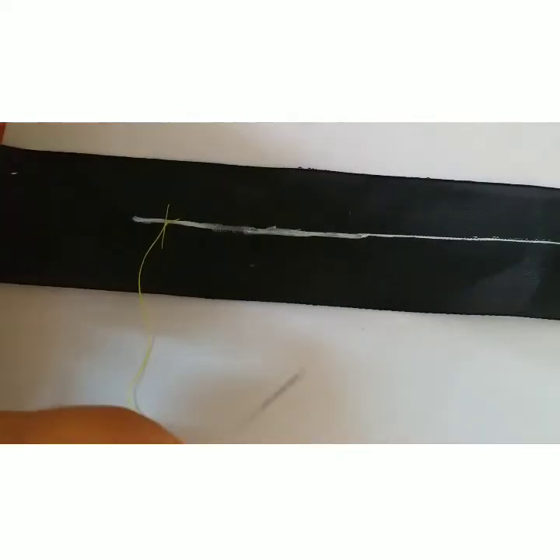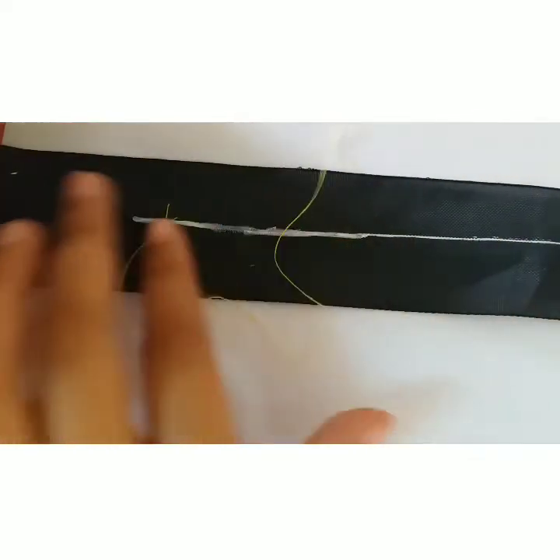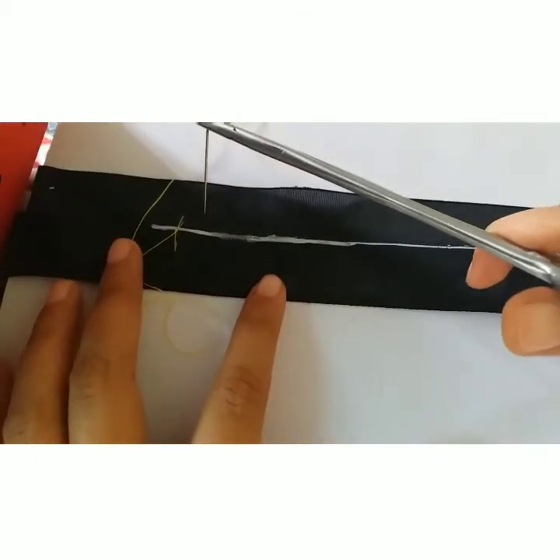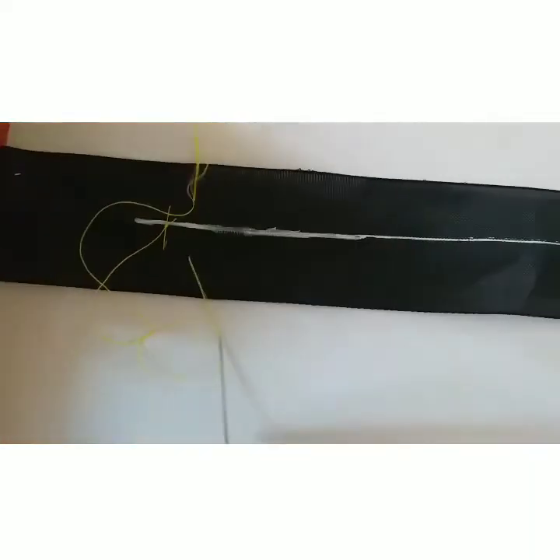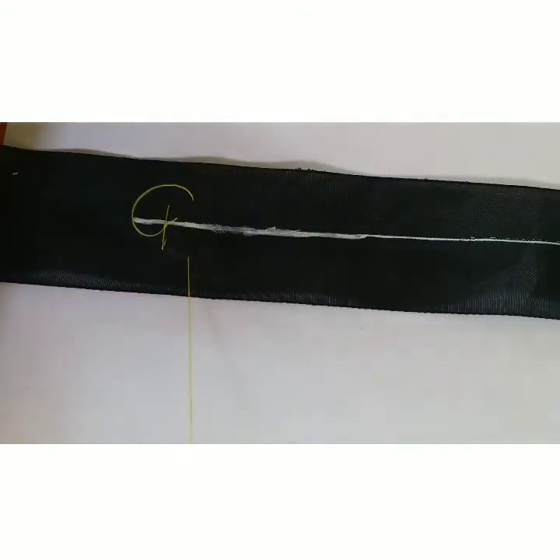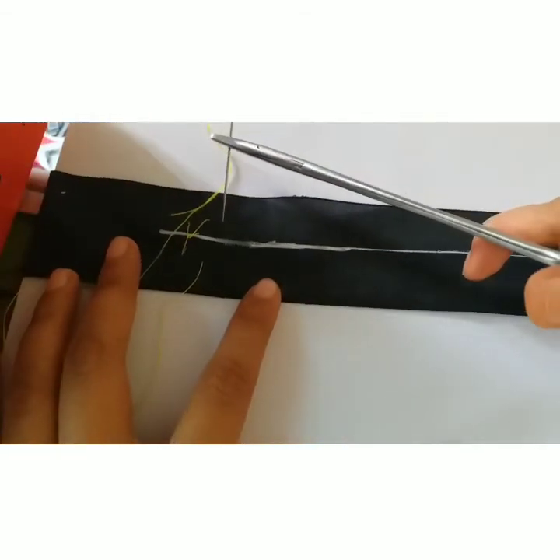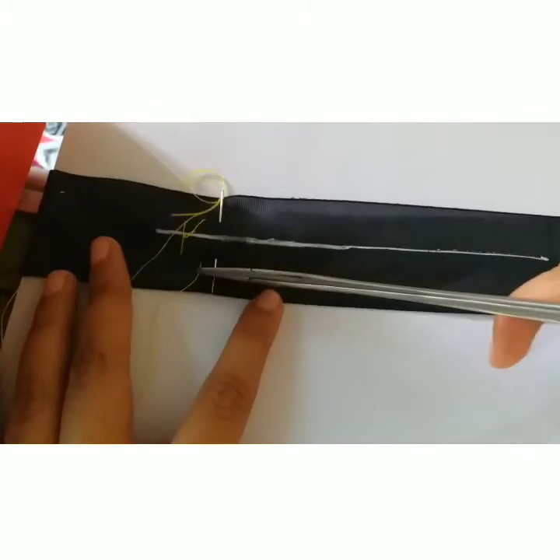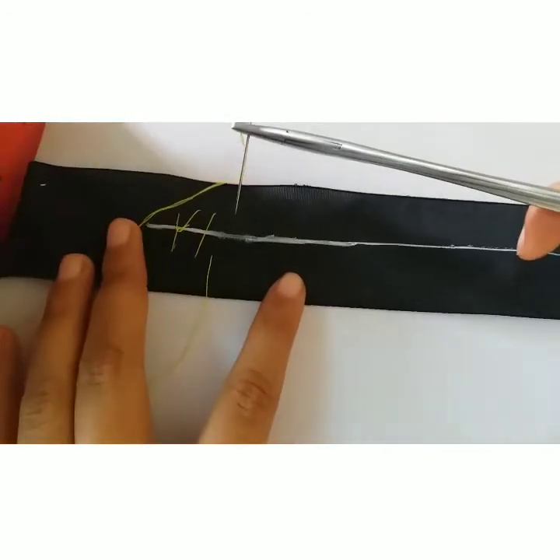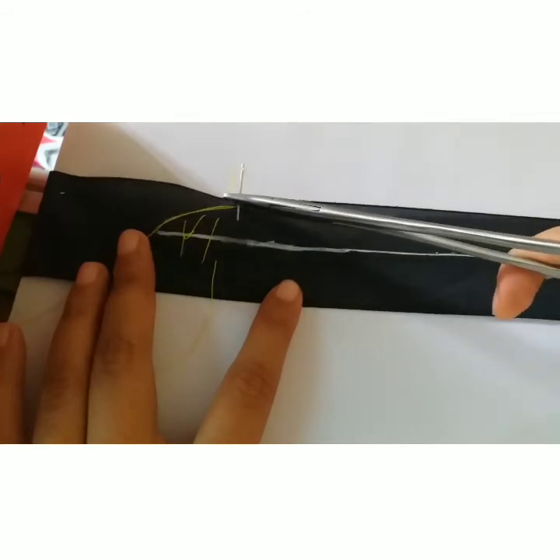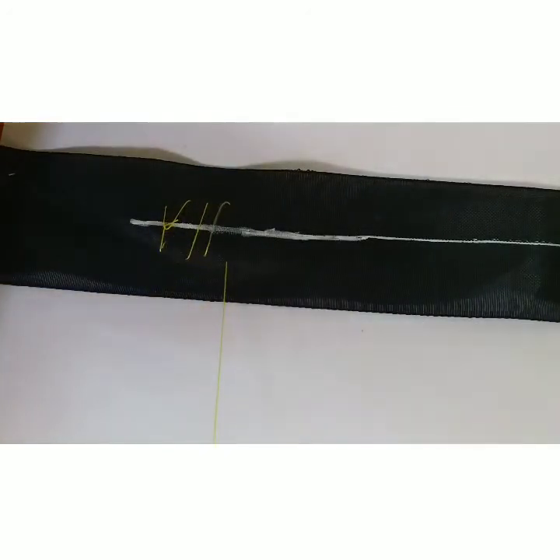Now we will continue this pattern in a continuous manner. This is the simple continuous pattern, and this is how we will continue this simple continuous suture pattern.